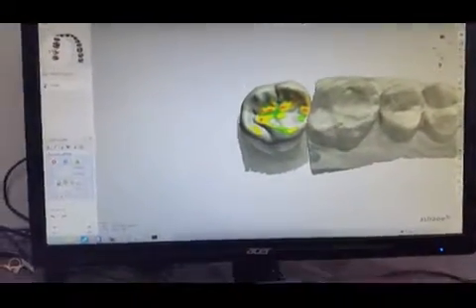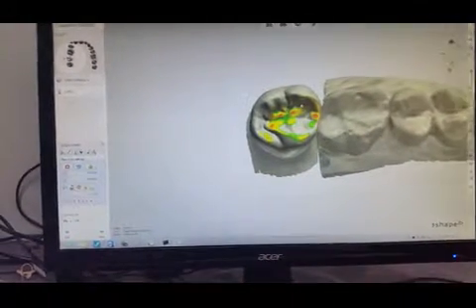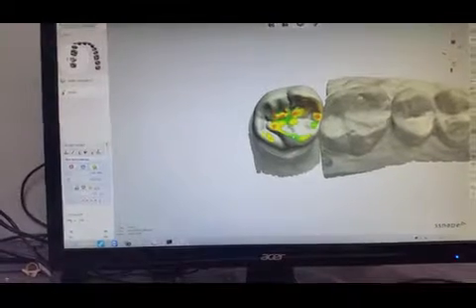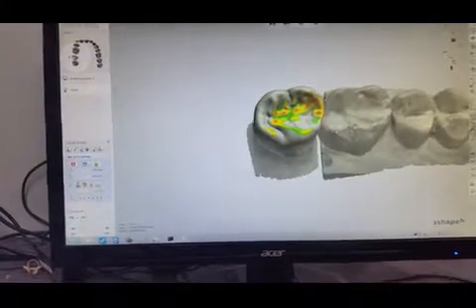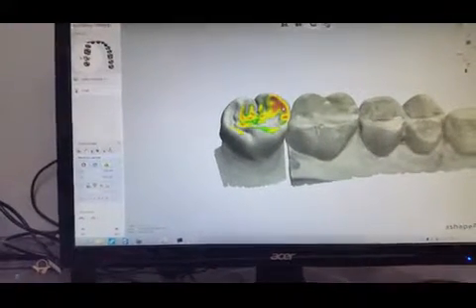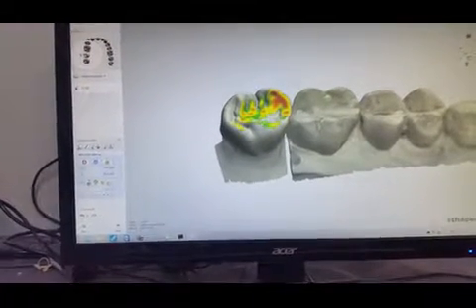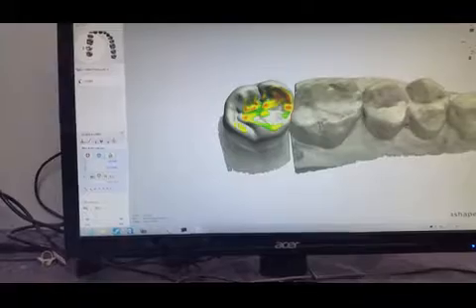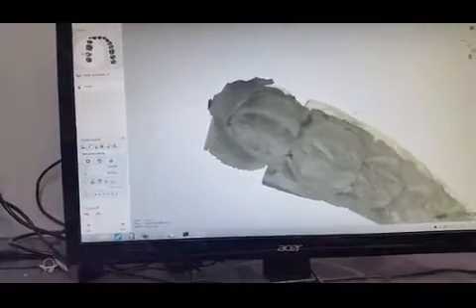Alright, so now I got rid of all the redness, all the heavy spots. I have a little bit of green and yellow and orange. That just kind of indicates that it's close. The orange, it's the closest. Yellow is somewhat close, and green, it's kind of barely there. And of course, where there's no color, then there is no contact, period. But we can see it's not penetrating the opposing.